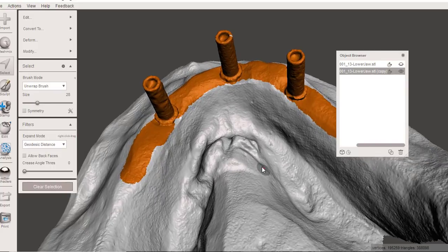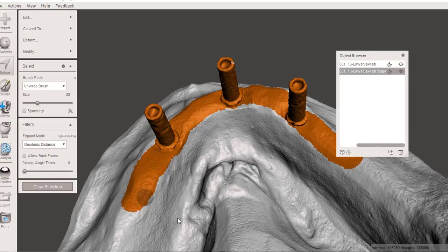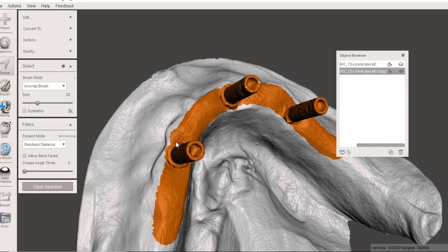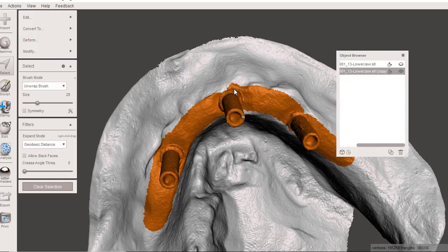I'm going to scale down my spot size, and I want this to encompass around each of the cylinders. So I'm going to make sure that it goes around each of them. And a little excess is better than not enough. If in doubt, extend it a little farther, because it's very, very easy to just take a lab handpiece and grind this printed resin back after the fact. I find that to be a lot easier than adding resin.